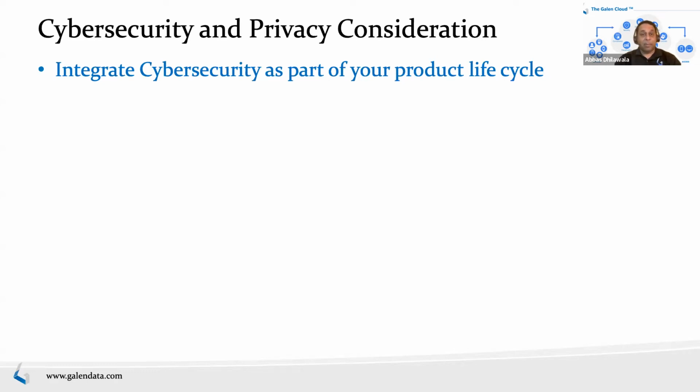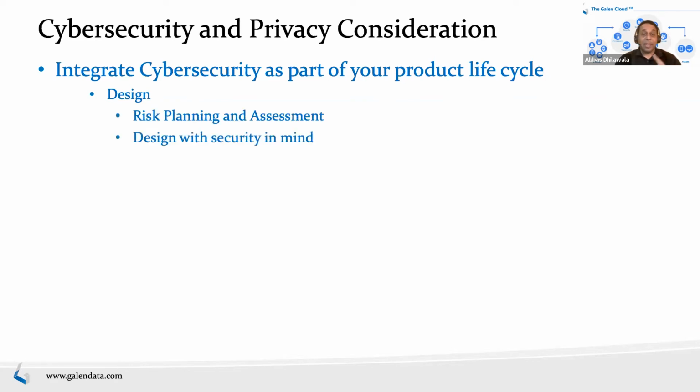It's much bigger, much more complex, but the most important thing in there is the idea of a secure product development framework. So what does that mean? Essentially, that you integrate cybersecurity into the entire lifecycle, not just at the end or the start, but through design. Which means you start with risk planning and assessment, and you design with security in mind to begin with. Then as you move into operation, production and then commercialization, you develop procedures and functions around managing cybersecurity, like a surveillance program. Like we do surveillance for safety risks, similarly surveillance for cybersecurity risks.